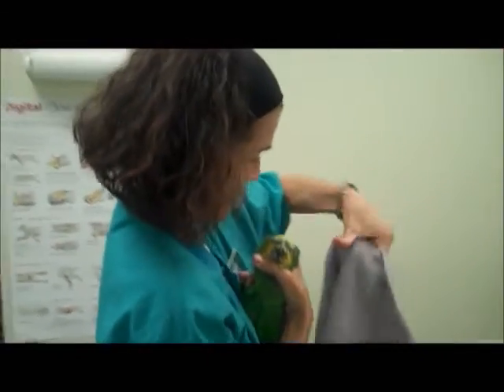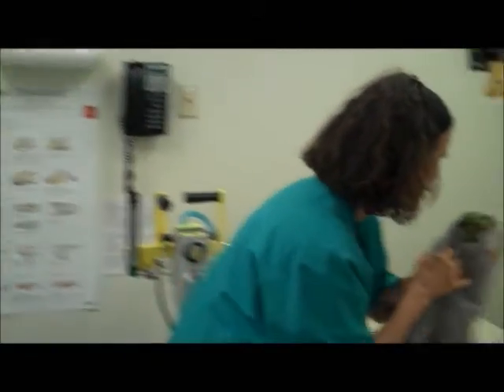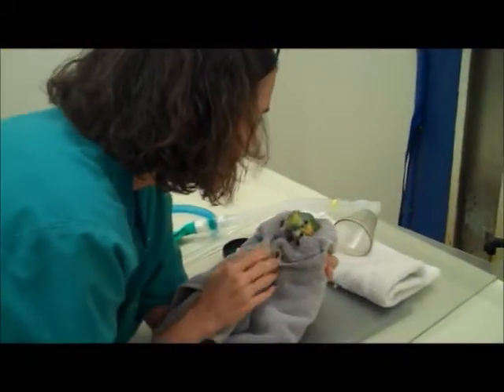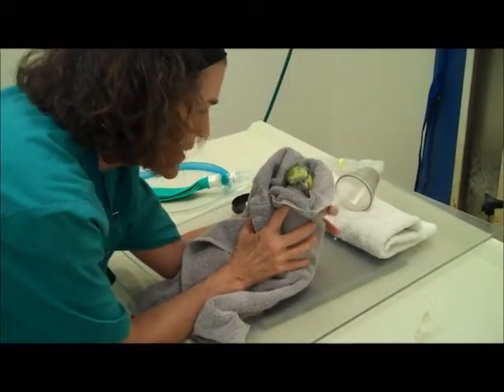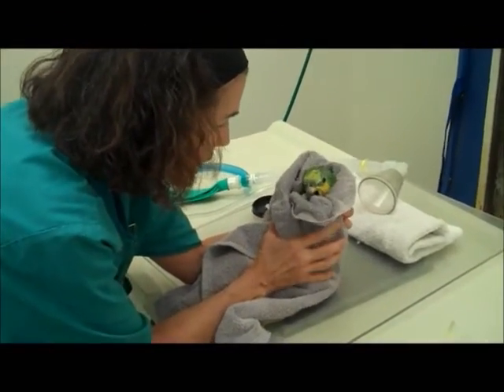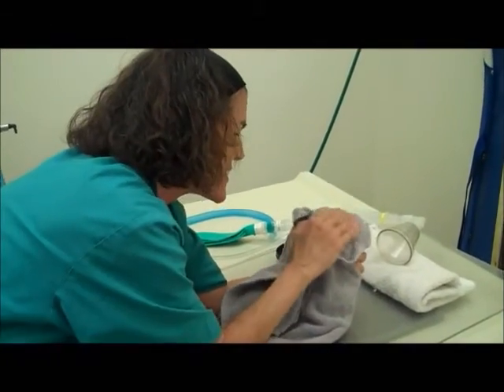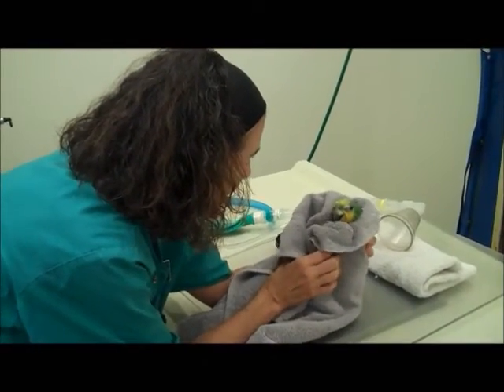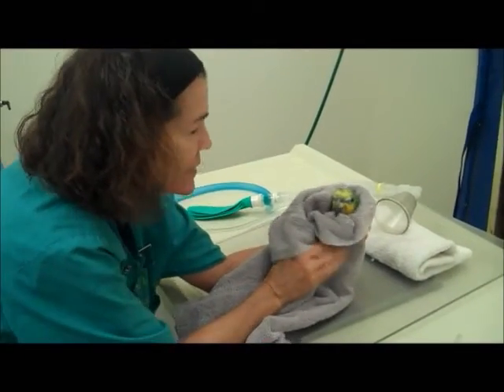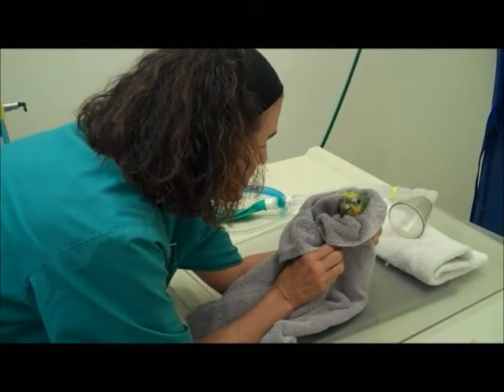I kiss him and grab him so that on the complete wake up, there's no flapping — we don't want him to hurt himself or try and take off. He's biting the towel; his muscle reflexes are back. Hopefully we've got a good radiograph. Good boy. We don't know why yet, but hopefully this radiograph will tell us.